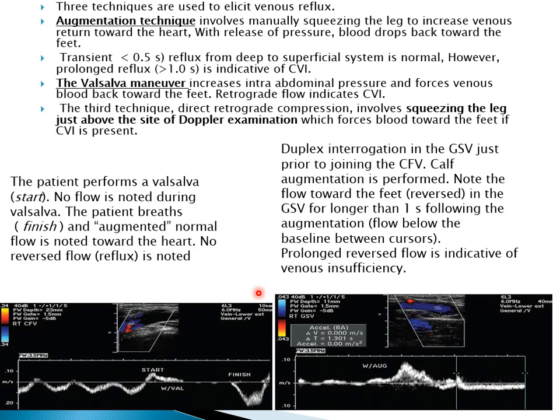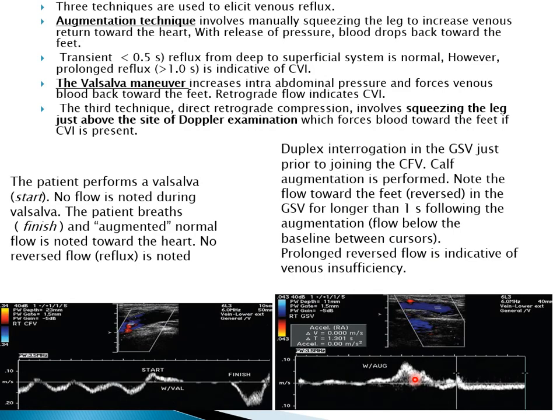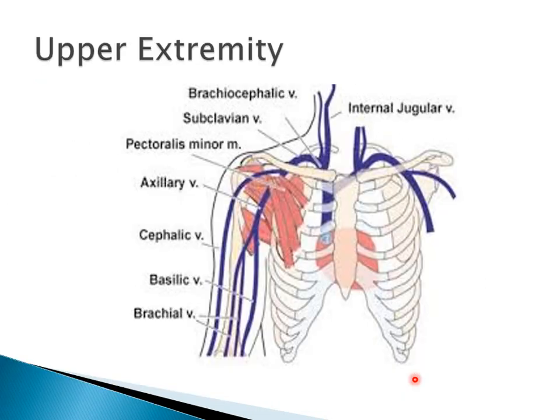The valve is incompetent. Okay, you can have the patient do the Valsalva maneuver, you can compress the calf, you can compress the abdomen, whatever you like. The important thing is that there is no reversal of more than half a second. If reversal is more than this, it is an incompetent valve. Squeezing above the level of examination, meaning if you are examining the calf, you squeeze the thigh to see the reversal. The blood is returning back to the foot, and if there is an incompetent valve, it will go to the superficial system.